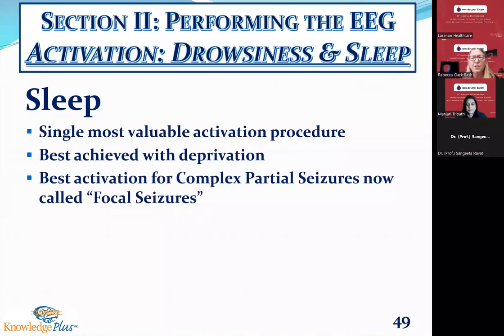And as far as positioning, the only position that doesn't work well with EEG: some people sleep on their belly with their hands above their heads. That doesn't work for us because it would mess up all the electrodes. But try to get them in as comfortable a sleeping position that replicates what they do back home.